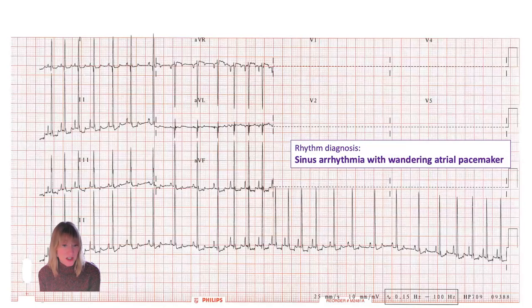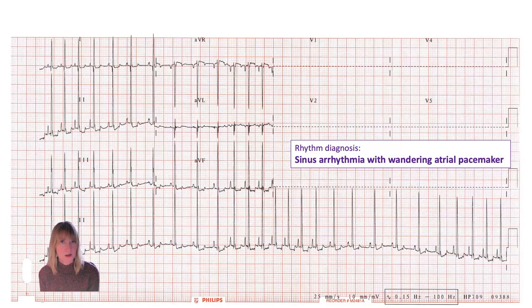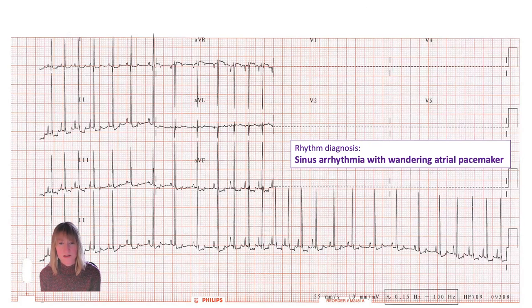So if we look back at our ECG, we get the smaller P waves when the heart rate is slower during that parasympathetic component, and then we get the taller P waves when the heart rate is sort of faster, albeit still in a gradual phasic sort of way.